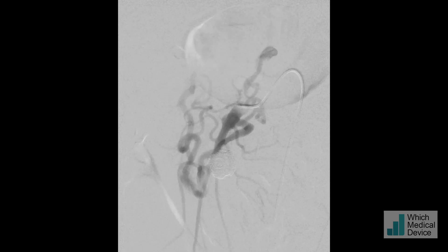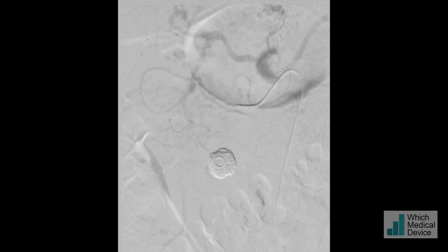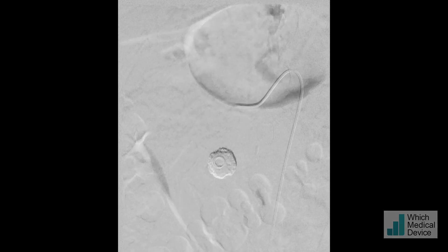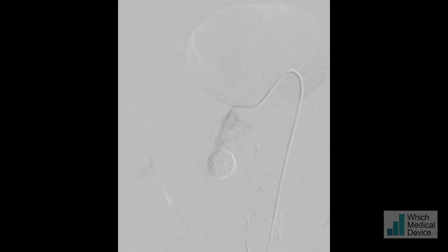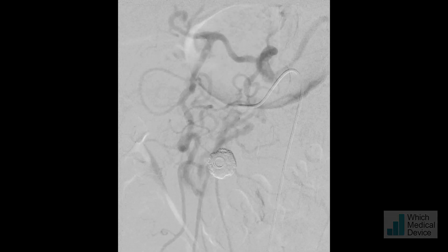Now you can see post-coiling and post-glue, the pseudoaneurysm has been completely excluded from circulation.